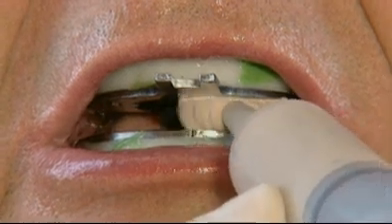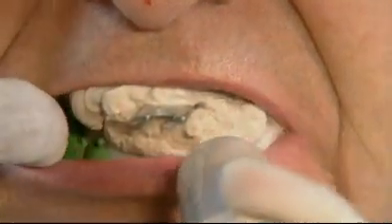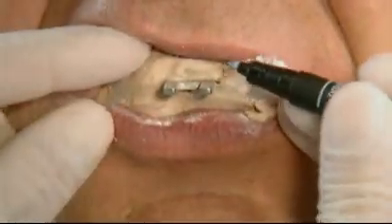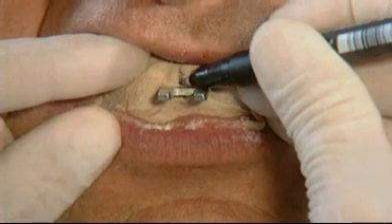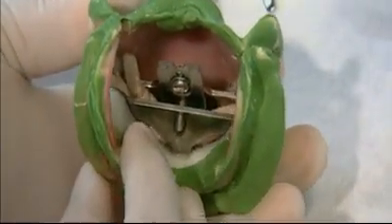Next, make a record of the registration with fast setting plaster. During this procedure, the registration pin has to be located inside the opening of the securing lamina in the mandible. Only the lips are slightly apart. Make sure that the UTS connection remains clean during this procedure. Carefully remove the entire registration from the oral cavity. The UTS and the registration are sent to the dental laboratory.